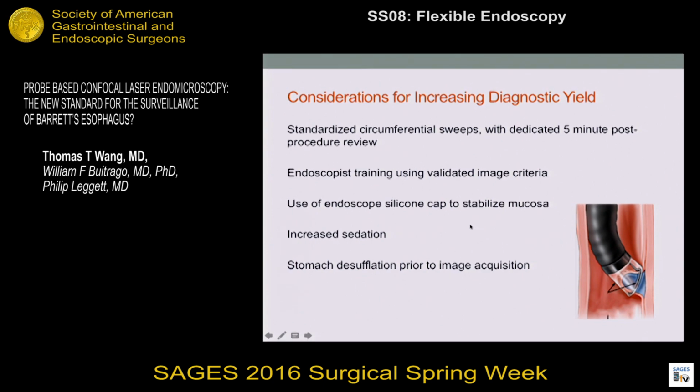And again, with the video that I showed you, the images are going by really quickly. So you do benefit from a dedicated 5-minute post-review. In approximately 3 of our patients, our 5-minute post-review enhances sensitivity of detection by catching the diagnosis that would have been missed if it wasn't reviewed. Finally, endoscopist training is a very important factor. This has been well described in the literature. Validated image criteria that I spoke about before are widely available for review and for online training and testing to increase your endoscopist detection rate.